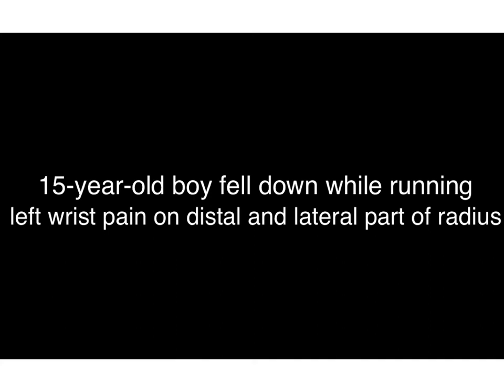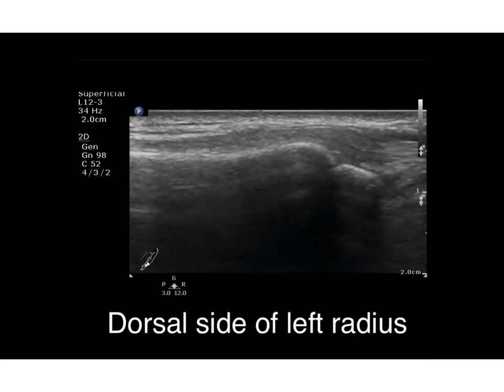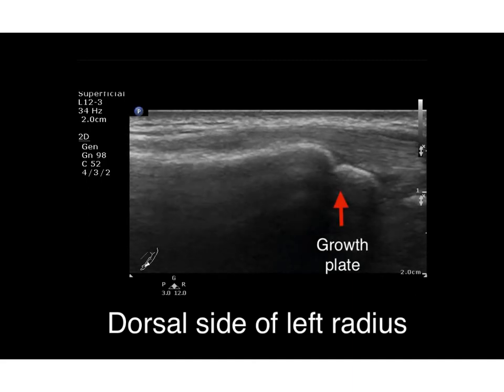Most of the time, I encounter patients with a refracture that we initially missed on standard X-ray and review, but the patient still complains. So listen to the patient. We use the linear probe to scan that region. Sometimes you can define that kind of cortical disruption. So, see these video clips from different sides. Initially, no fracture. Then I scan the dorsal side, no fracture.